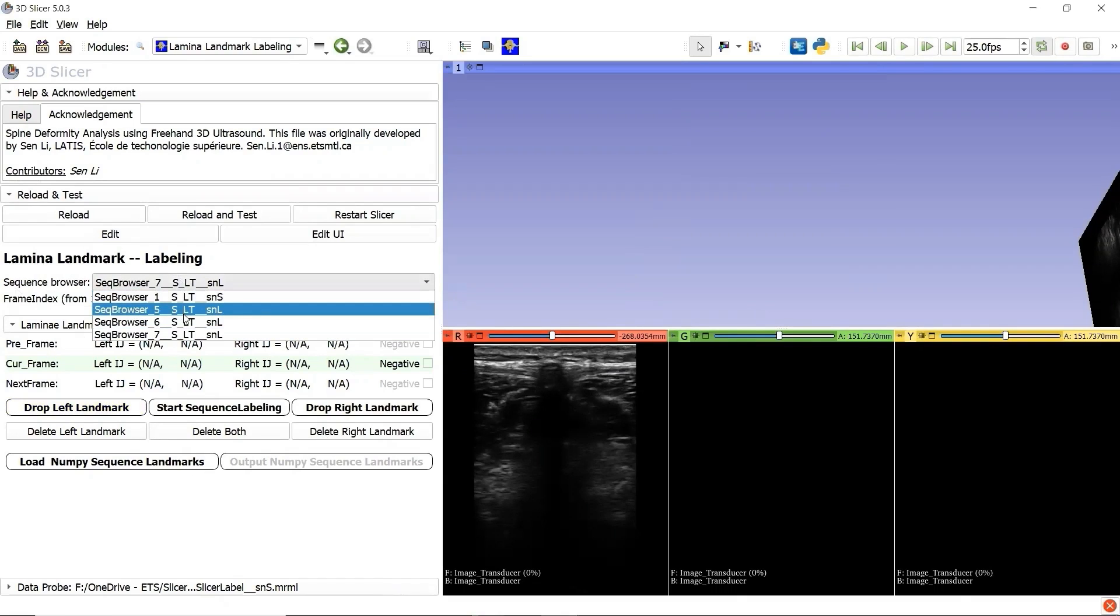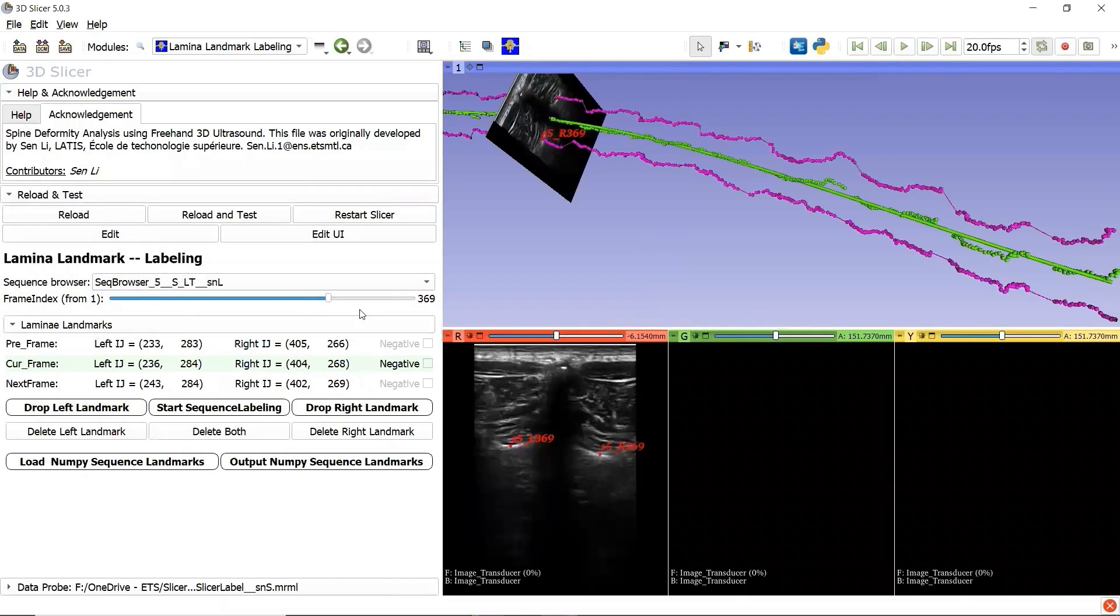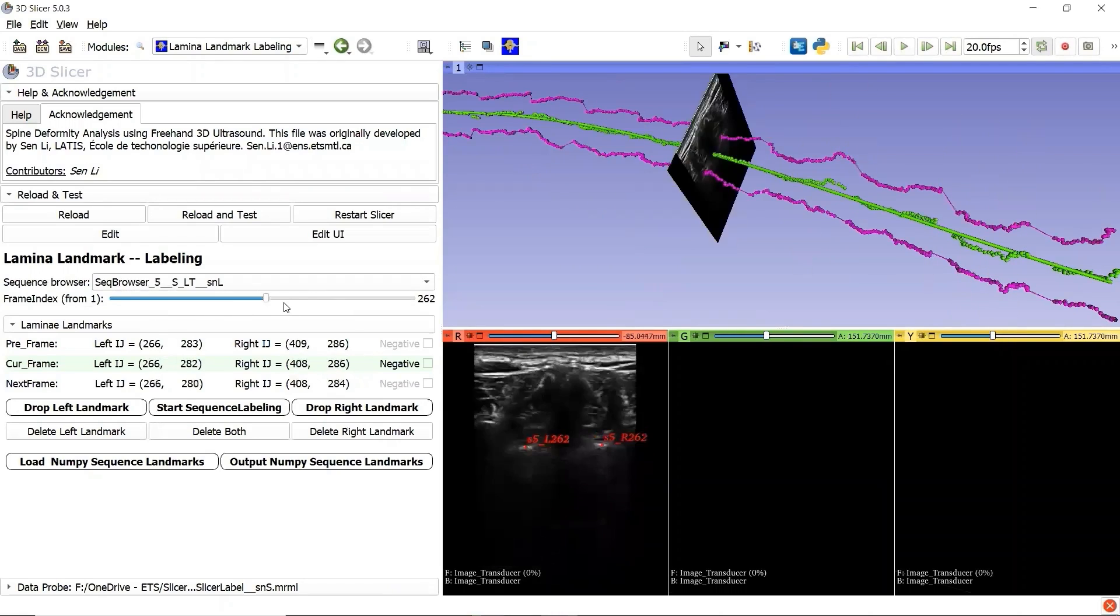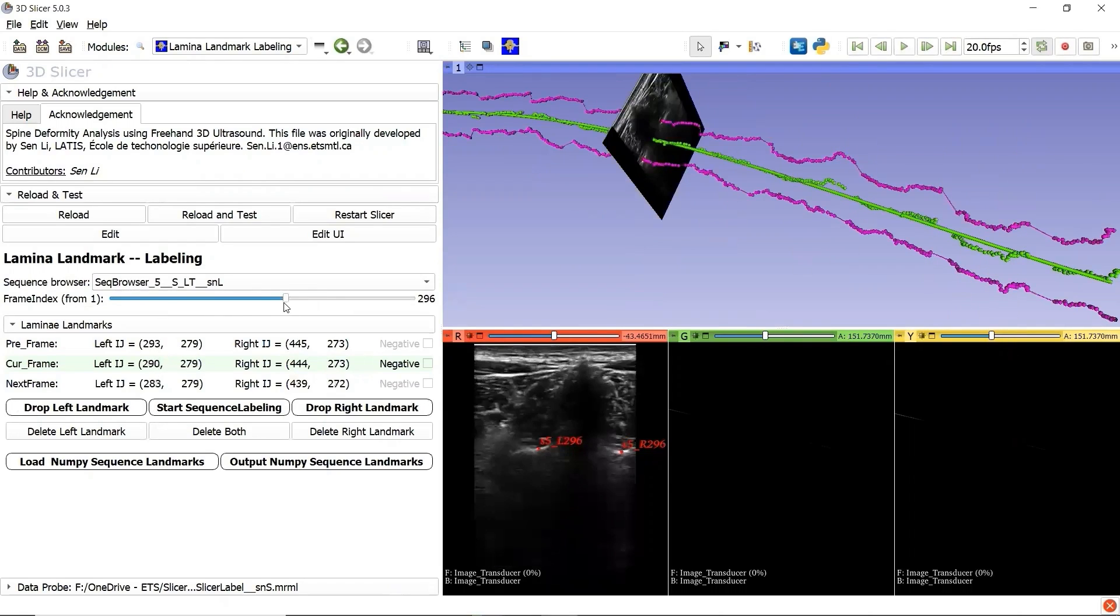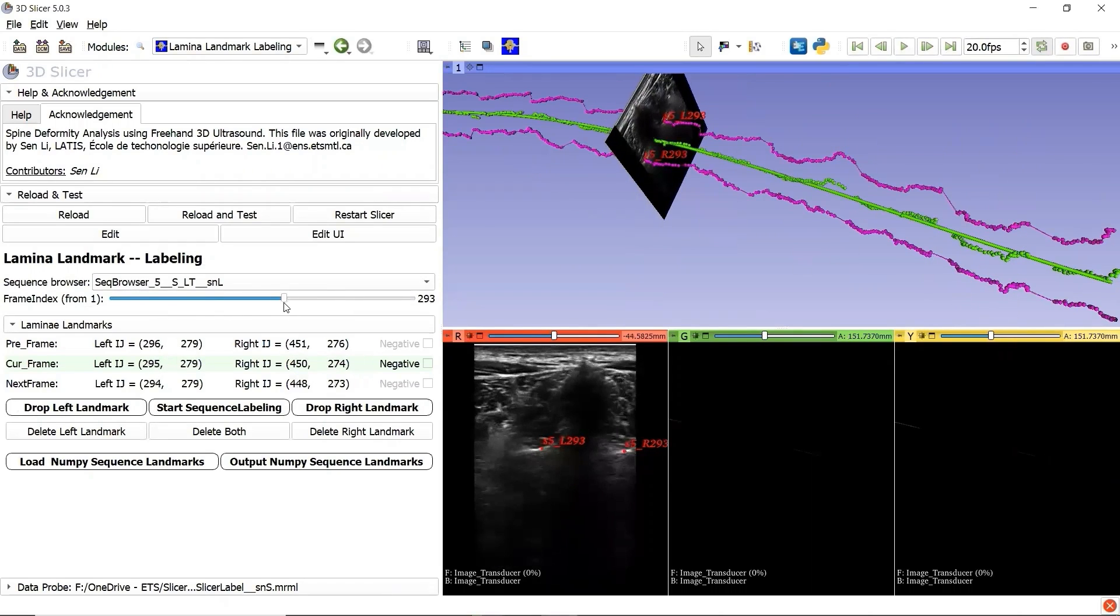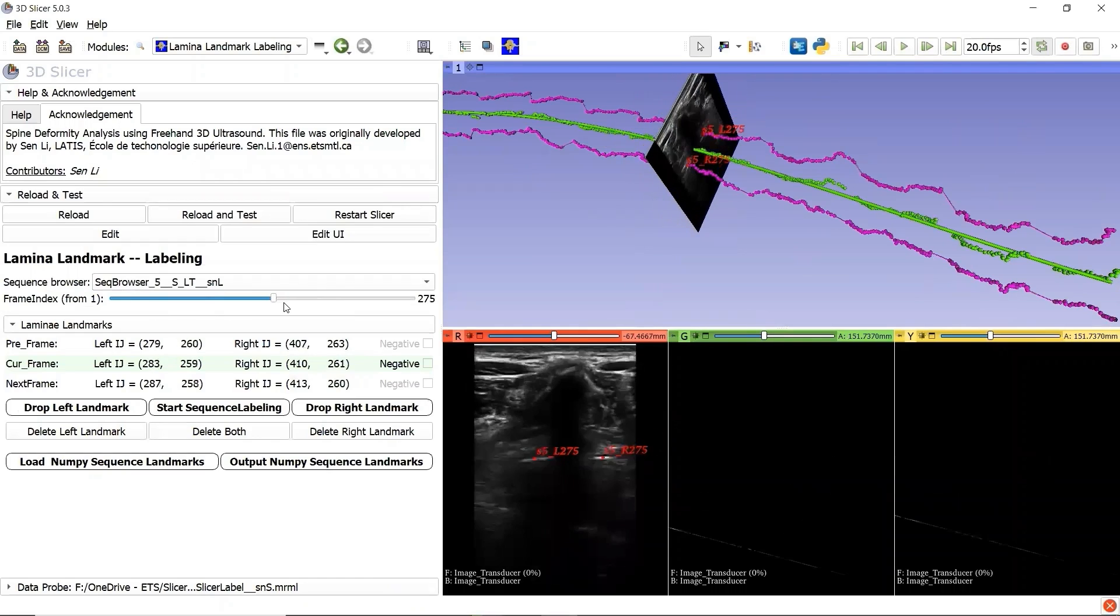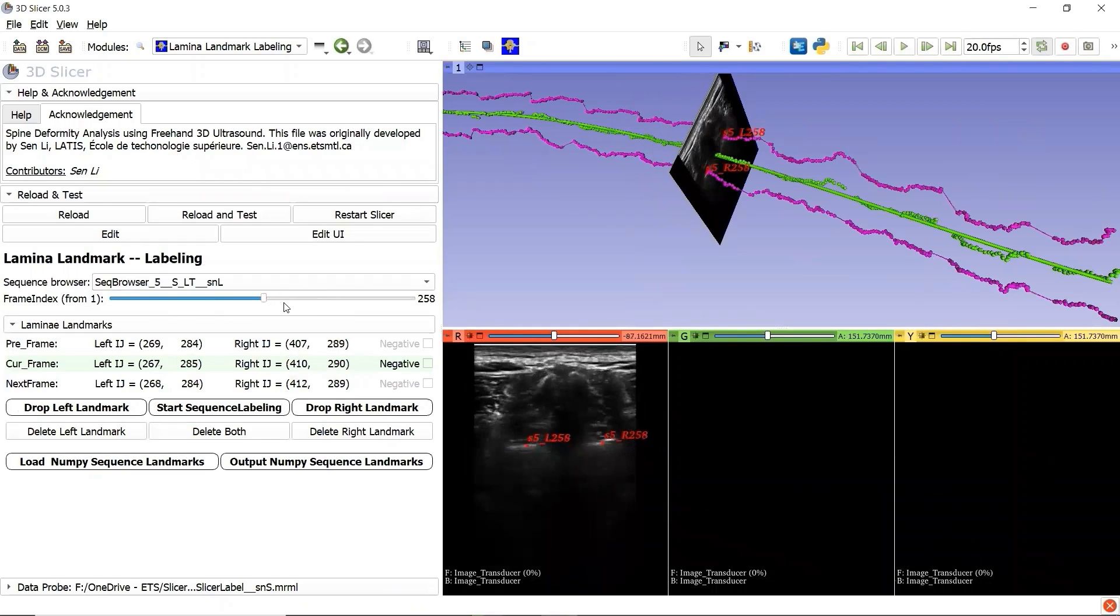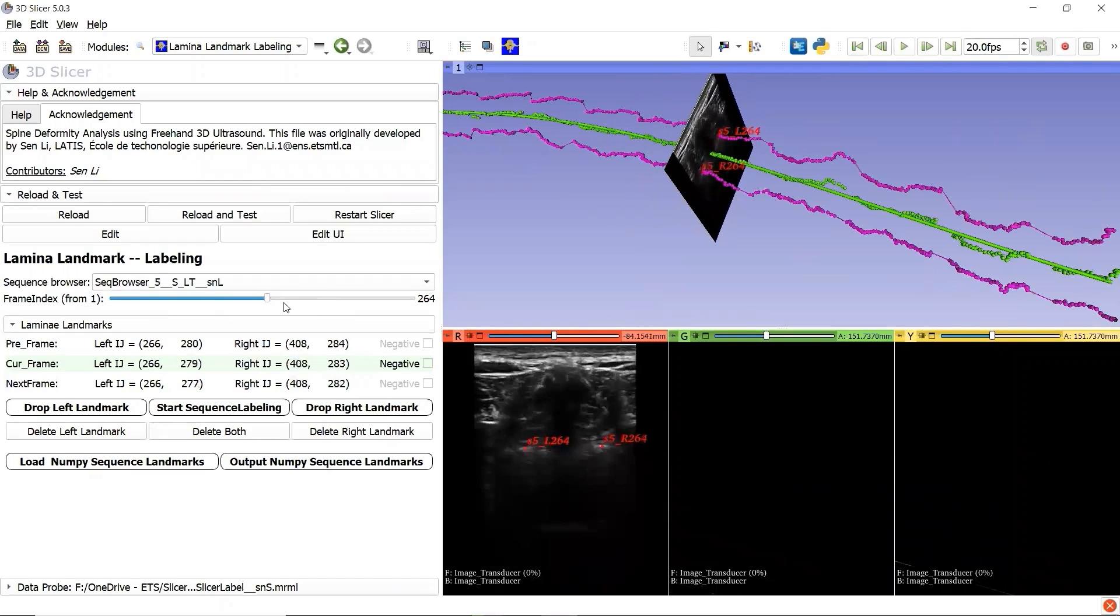We can view the whole sequence by moving the slider, or we can just press the keyboard button left or right to decrease or increase the frame index.